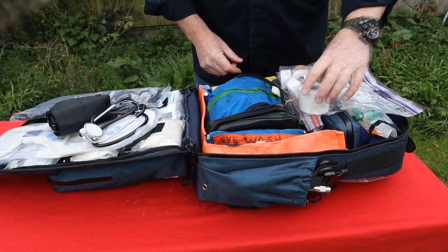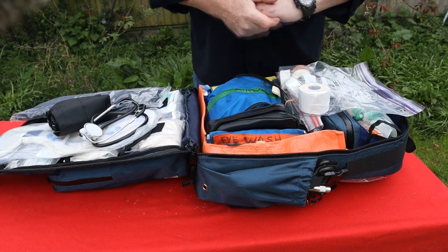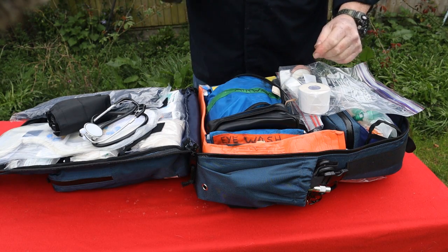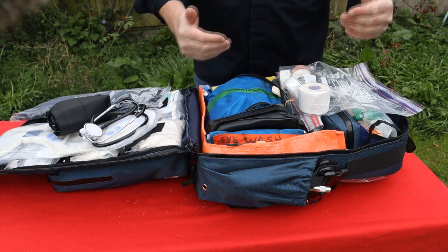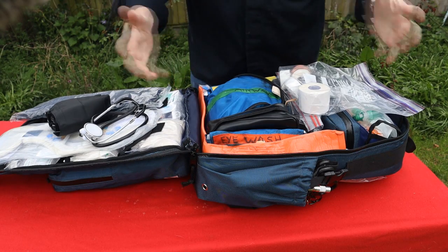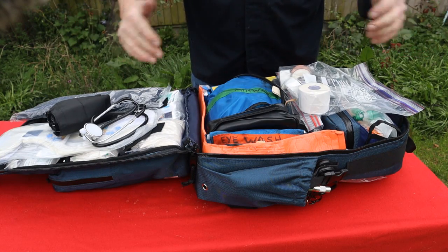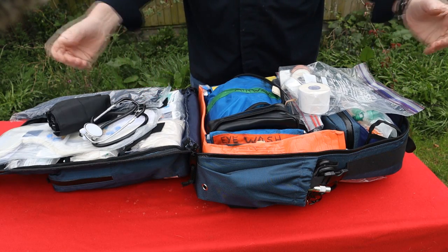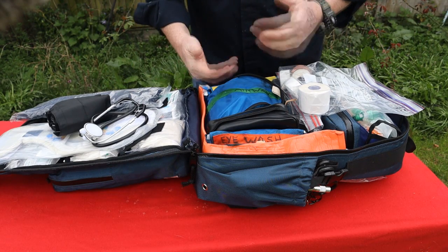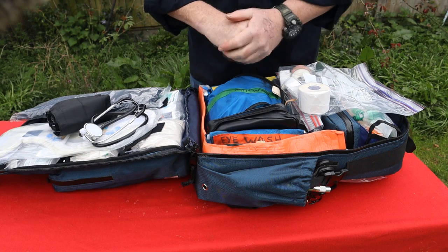This 2-inch fabric tape is great for holding IVs, cannulas, that sort of stuff in place. If someone on scene gets IV access, it can't come out. If it comes out and the patient is traumatized, first thing that happens is the blood supply to the periphery is switched off and shut down. All those blood vessels constrict, and then it gets to a stage where you're trying to put a needle into a piece of cotton. It's almost impossible.